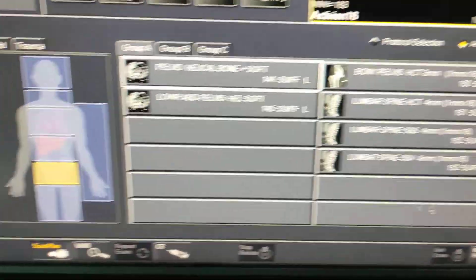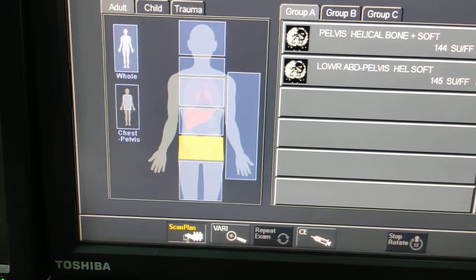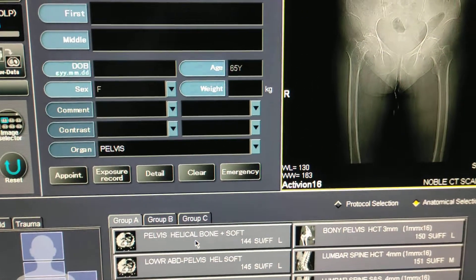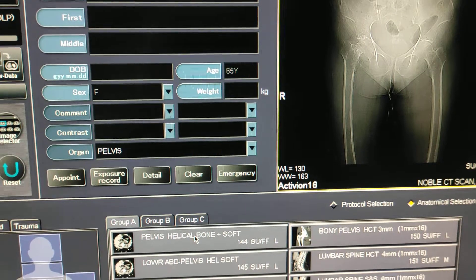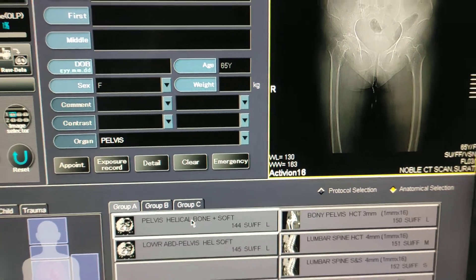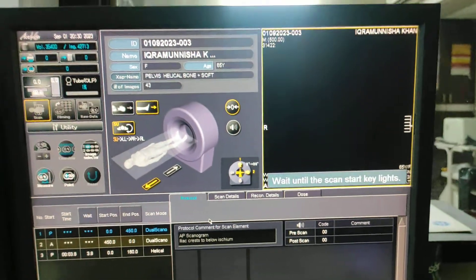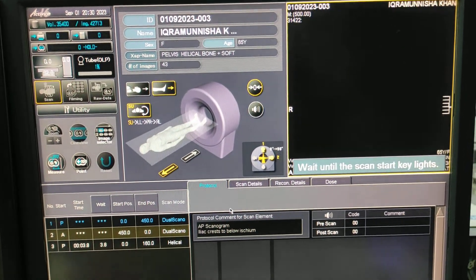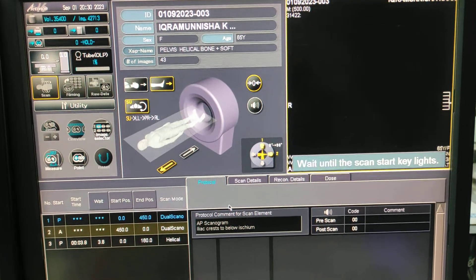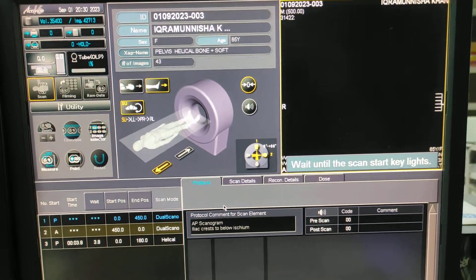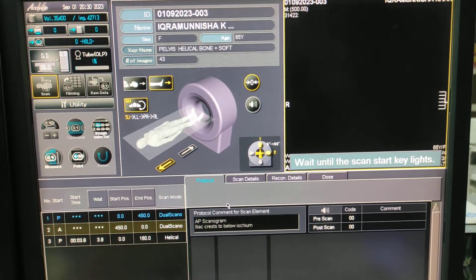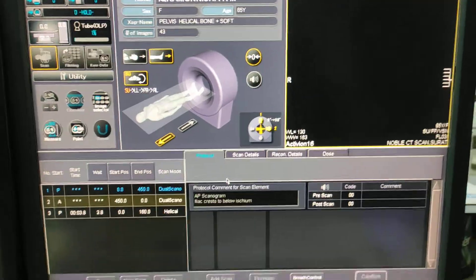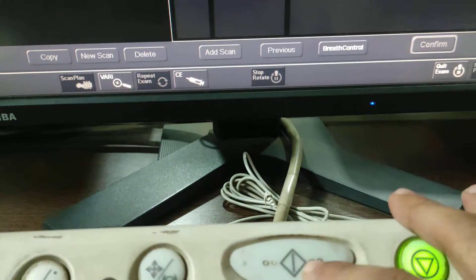You can plan on this scanogram also, but here I am taking another scanogram to show you. First, quit the exam, then click on the scan plane, and again click on the protocol. Click two times to take the new scanogram.